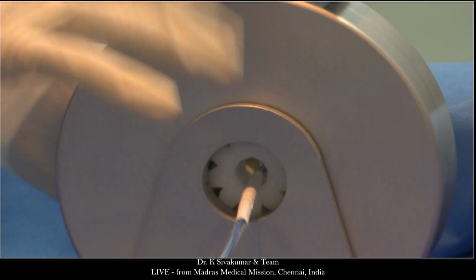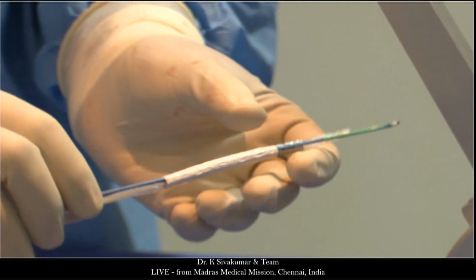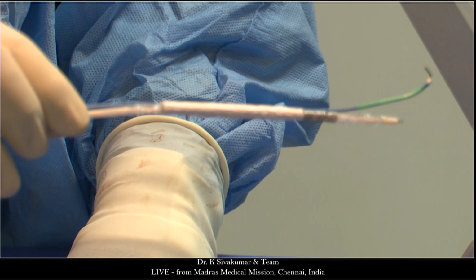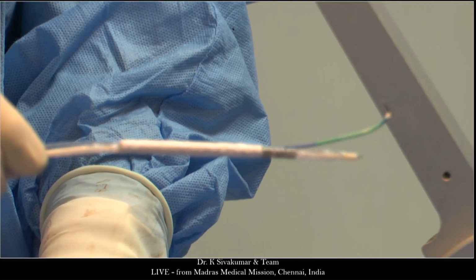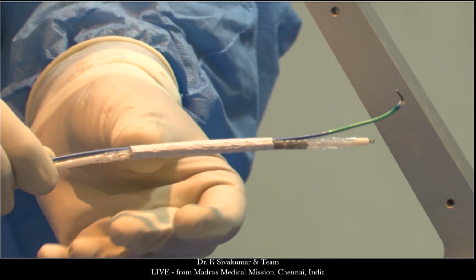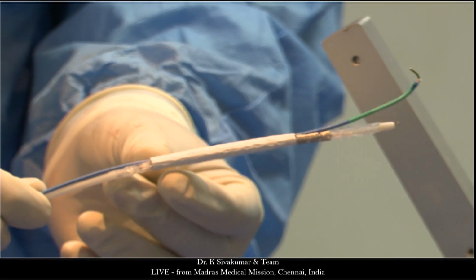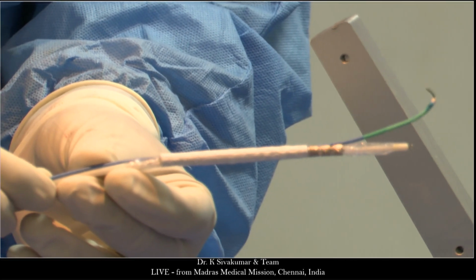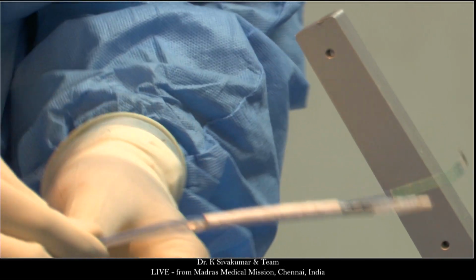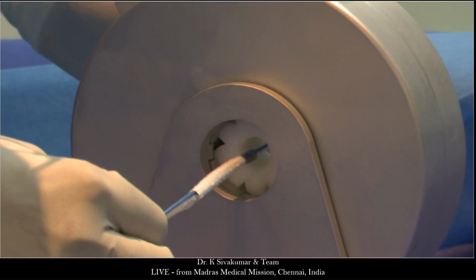I will show you before I tighten the crimping further. Can you get it focused? So here, I'm using a double wire, one catheter plus one balloon, single stent strategy. Are you able to see it? Can you see the picture? Yes, very clear. Very nice. So I'm going to use further crimping in order to get it into a much lower profile.